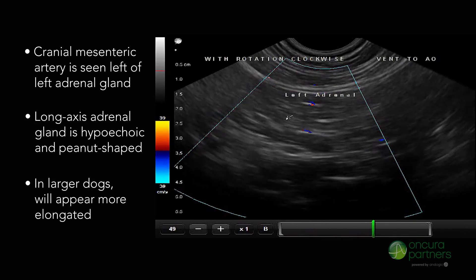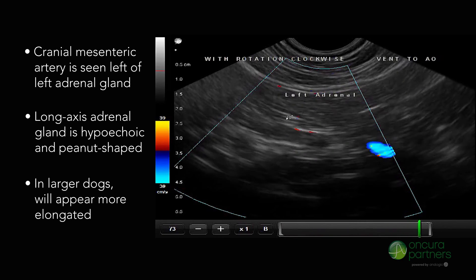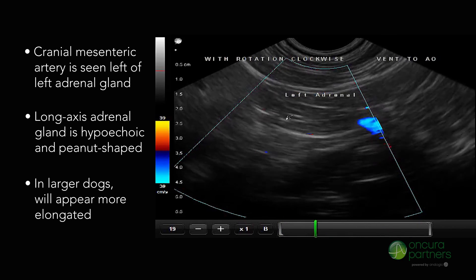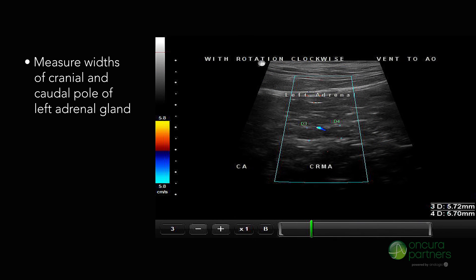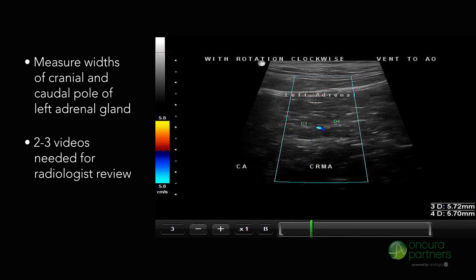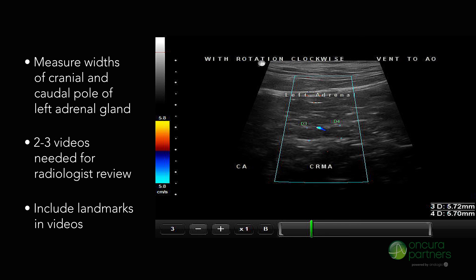In larger dogs the adrenal gland can be more elongated. With high frequency transducers, the cortex and medulla can be readily seen. Measure the widths of the cranial and caudal poles of the left adrenal gland to compare with normal references. Note that at least two or three videos are needed of this area for the radiologist to conduct a proper review. Even if the adrenal gland cannot be readily seen, it is important that the anatomic landmarks are included in these videos.